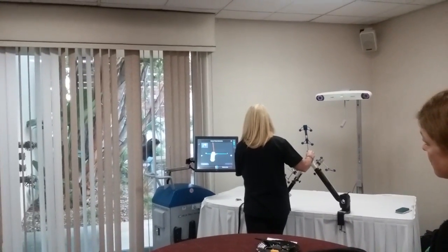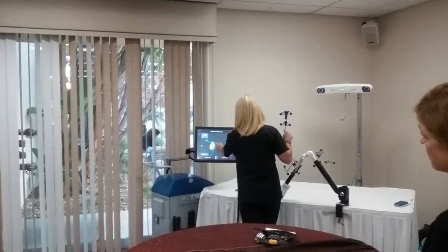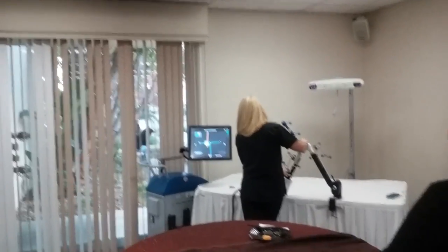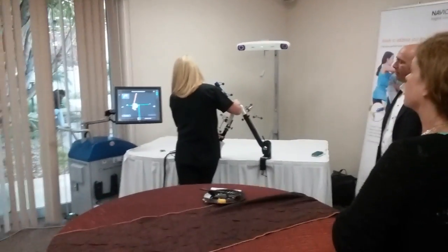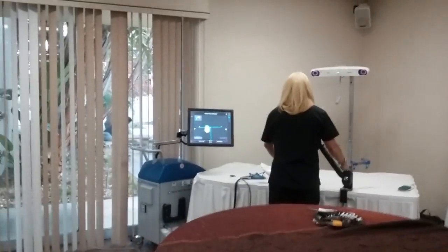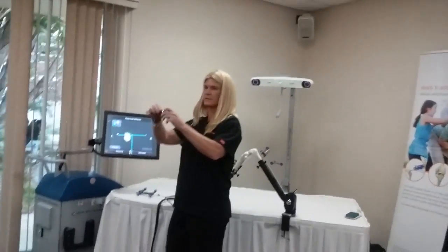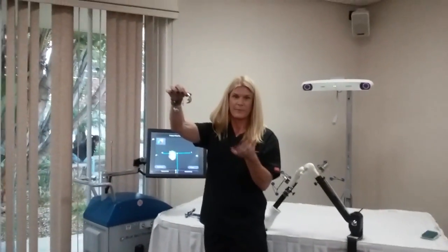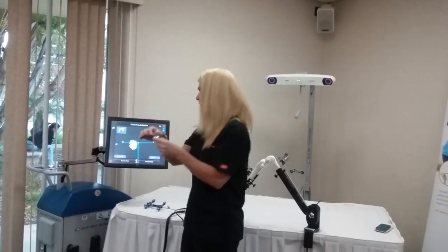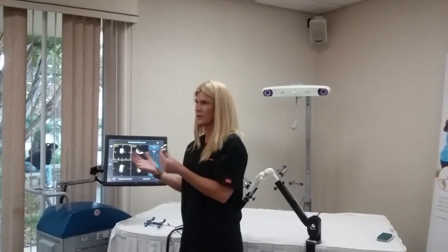So these are all my data collection spots here. And I can move the screen to get more data. So once we've captured all this anatomy from that patient, our goal is to place our implant, which looks like this, because we're now taking away that bad bone and replacing it with an implant so the patient has no more pain, so they can walk better. So we want to place this implant correctly, right? We don't want to place it somewhere it's going to hurt the patient.